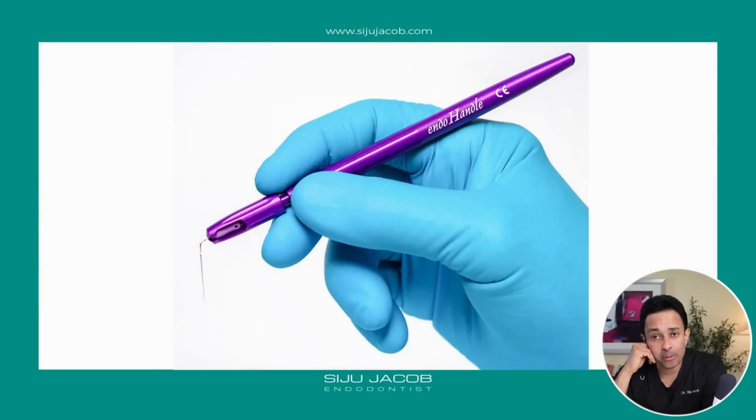These days, micro openers are expensive. So a less expensive option is something called the Endo handle. Many companies offer this, but I think the one we prefer is from Venta Endo. Again, I'm going to put the link of all these products below the video so you can have a look.